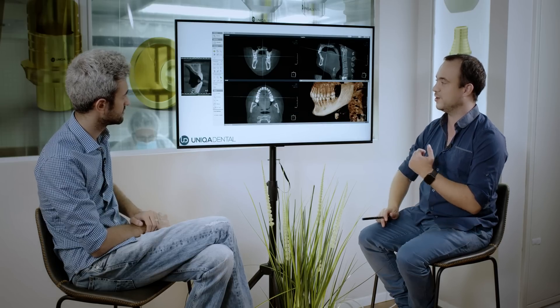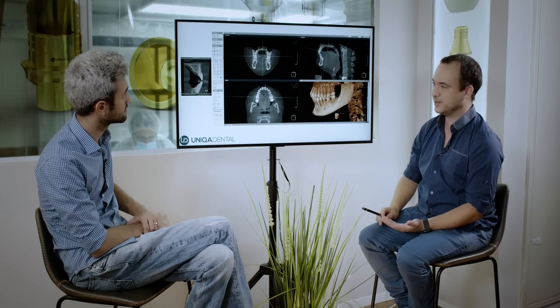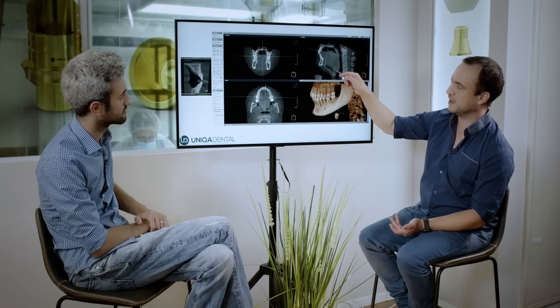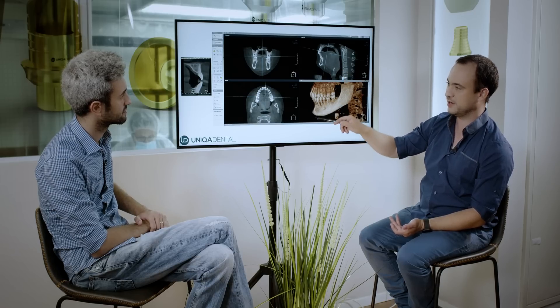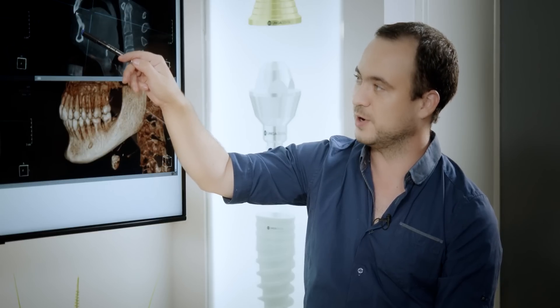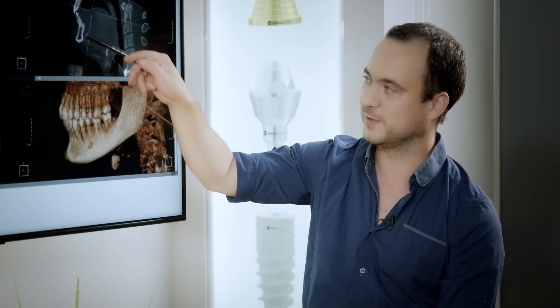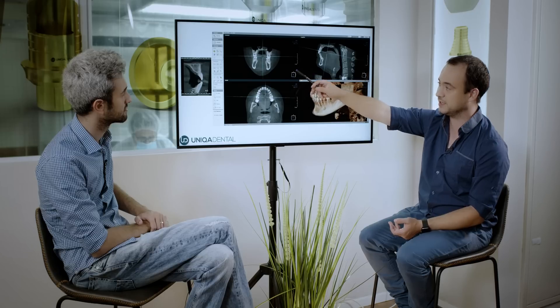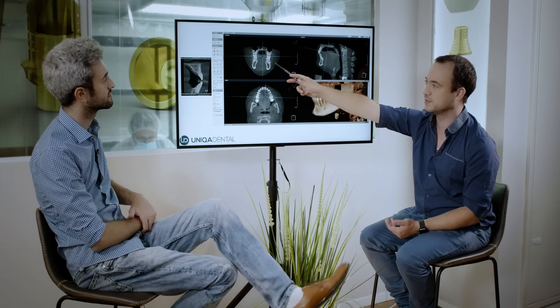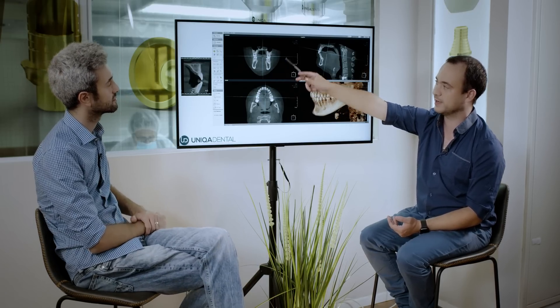In here I already have much more information. In the anterior area I can see the frontal bone, the height of the bone, the width of the bone, the teeth, the cut of the teeth itself. In the left-to-right slice I can see in the lower parts the height and width of the bone, the teeth, and different structures.